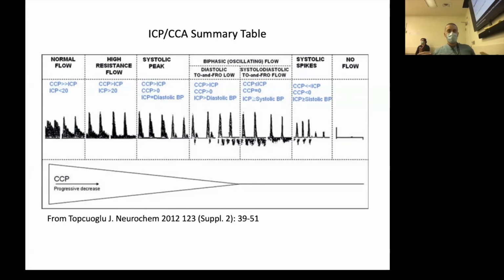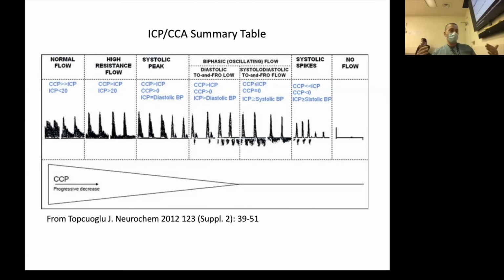The problem is that there's a paucity of standards within the literature for insonating the other vessels, because you run into the same problem where you want to normalize to an extracranial vessel. Various groups have used various different vessels, whereas the MCA is always MCA over extracranial internal carotid artery, your Lindegaard ratio. Does that make sense?